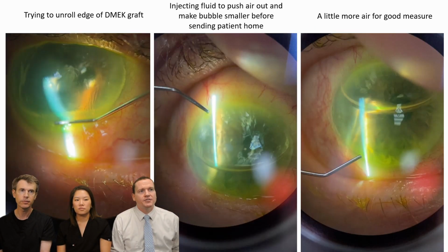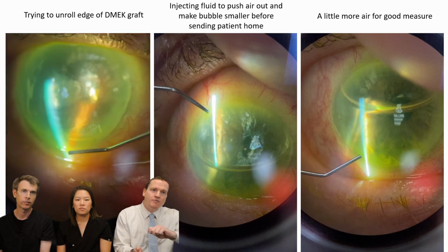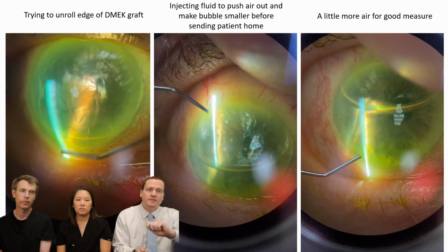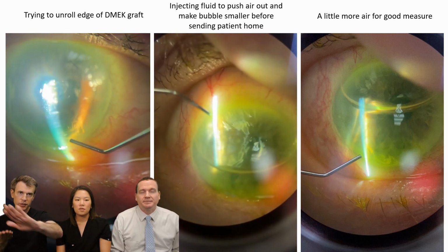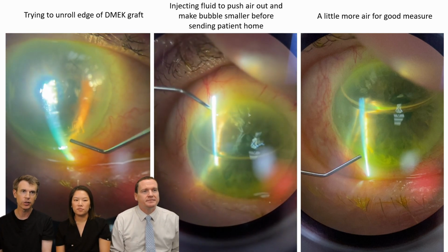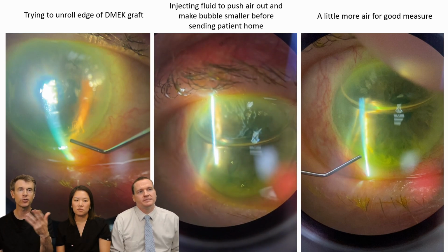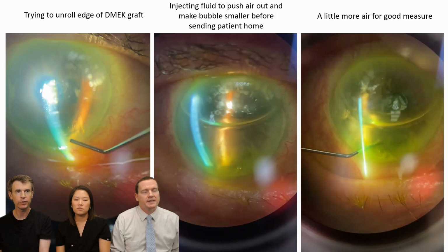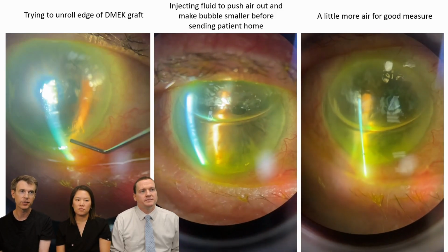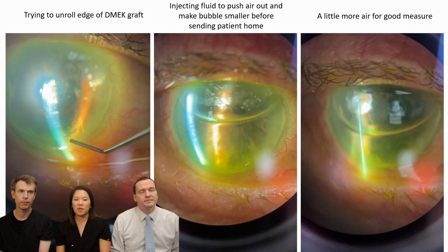Get the air in there, trying to press that DMEK back on. Still back to that technique that we saw in the operating room with the flicking type motion on the surface to try to get that to unroll properly. It's like ironing things out, getting the fluid out of the interface. There's little slow strokes, and replacing some of the air with BSS so there's not too much in there, and the air is filtered. It's not just room air, it's filtered through a micron filter, so you have sterile air before you place it inside the eye. And this patient will have to position afterwards. Just keep that in mind.